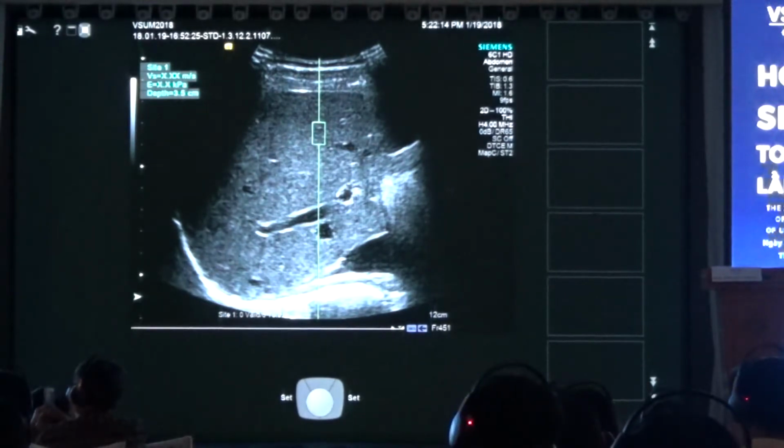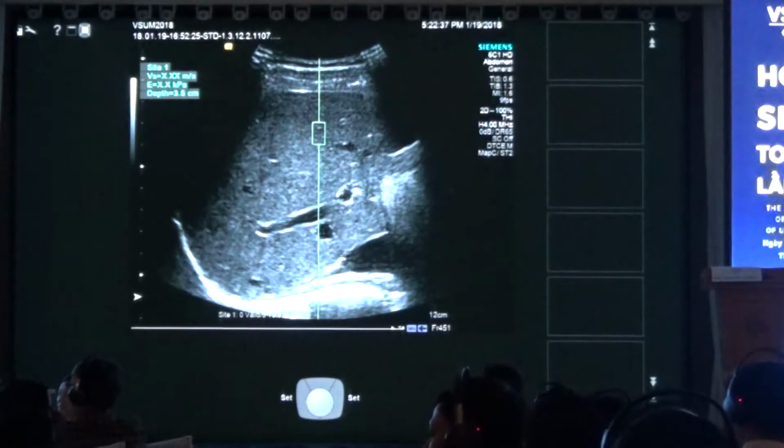One good measurement is better than 10 bad measurements, I would say. So always go for quality, take your time for a good position of the patient, optimize, and give all the information you might get into your personal examination technique.